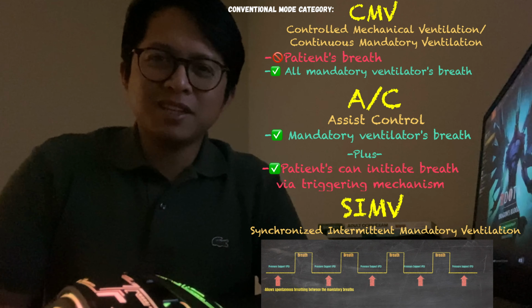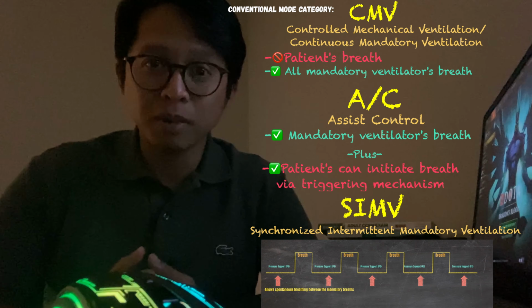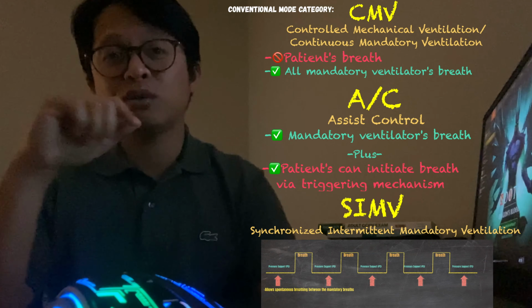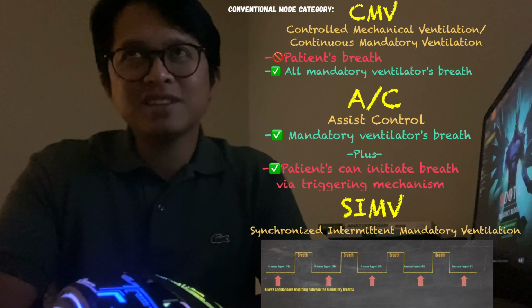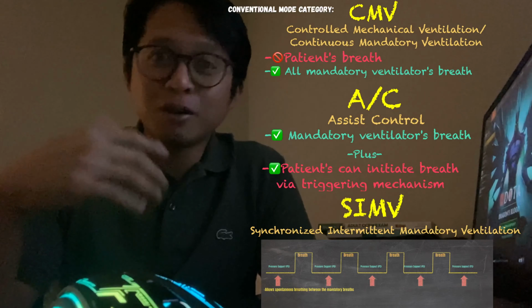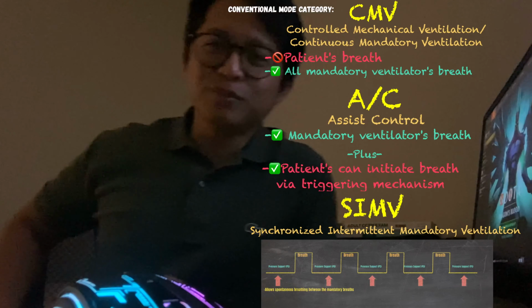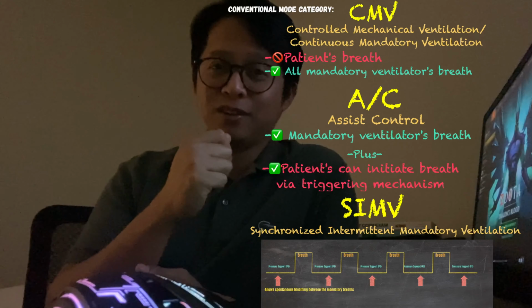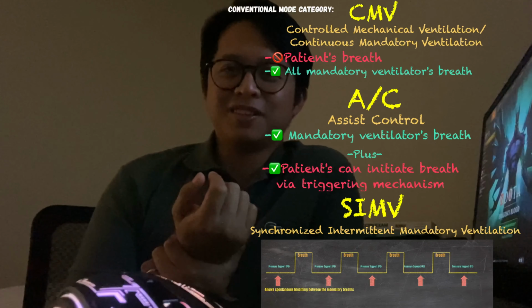we can't imagine how it feels to be intubated because most of us haven't experienced it yet, to breathe in that narrow tube, right? Adding up the whole length of the ventilator circuits, that will surely contribute to the work of breathing. Now, try to grab an endotracheal tube size 7.5 or 8 in your area and seal it in your mouth and breathe on that. I'm pretty sure it's hard.